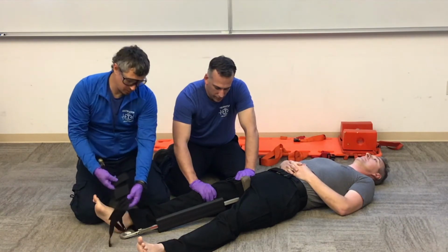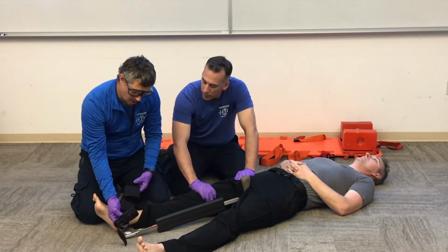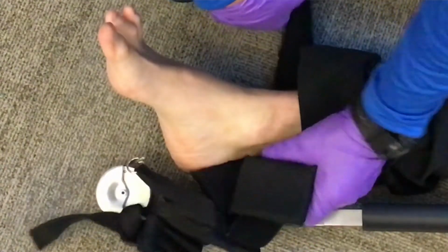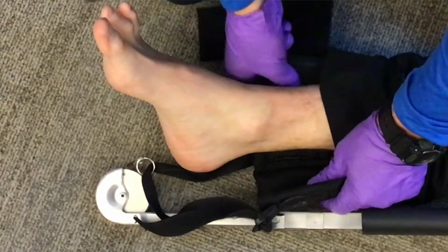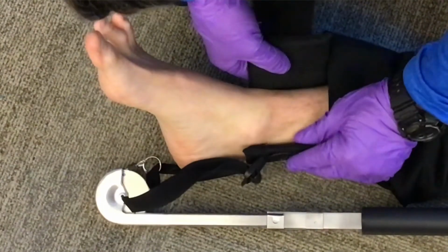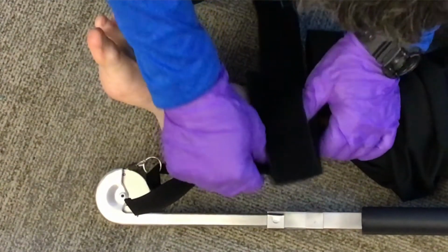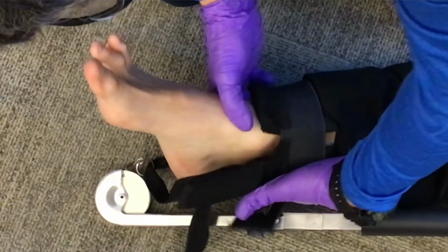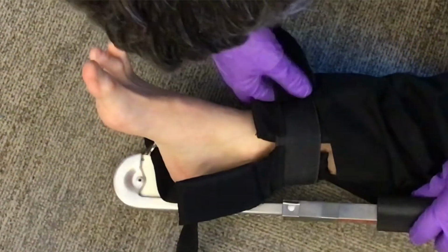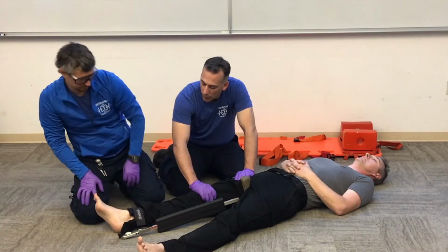Then we're going to take our ankle hitch, slide that underneath the patient's ankle. We're going to position that just above the malleolus and secure that tightly around the patient's ankle.